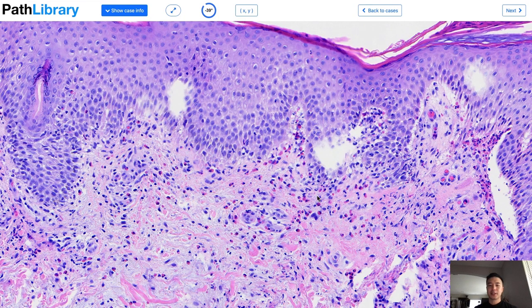Your differentials include EBA, and we talked about how to differentiate that. Porphyria cutanea tarda shows a split at the DEJ. Rigid dermal papillae protrude into the bulla, and this is known as festooning. There are usually PAS positive eosinophilic epidermal globules, sometimes known as caterpillar bodies.